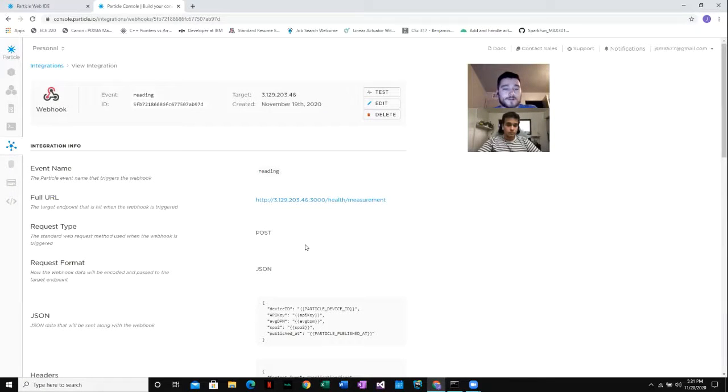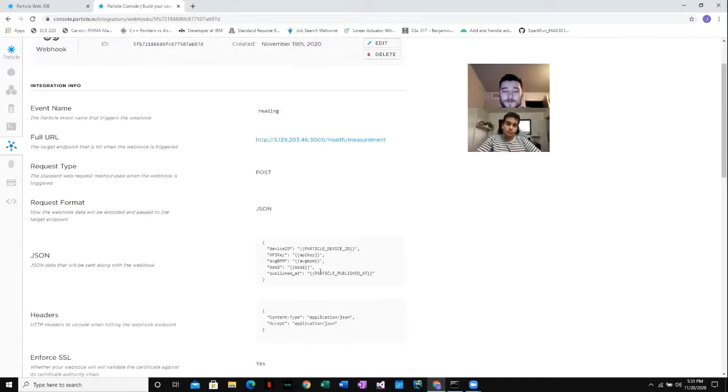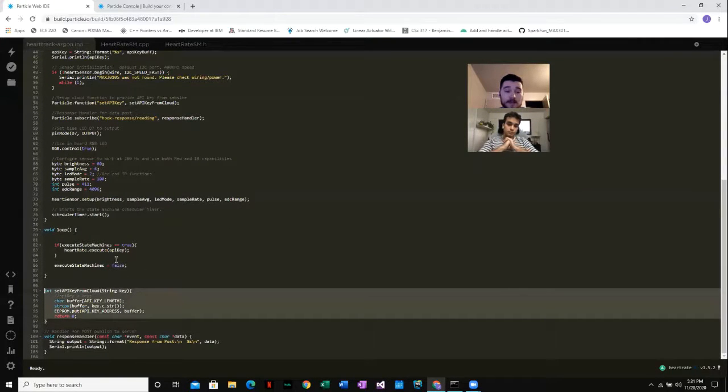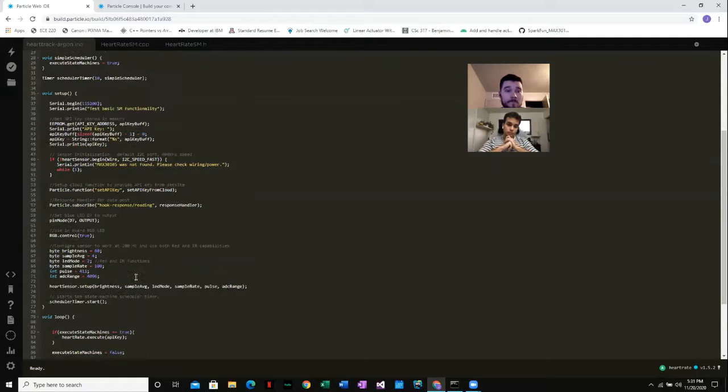I'm going to go ahead and show you the webhook that we have. It is connected to the server URL that Kevin showed earlier, and our endpoint is health measurement. That's where we're posting that information. We are posting the particle's device ID and the API key that's stored in the EEPROM. That's one of the reasons why we have to have the device on when you register it, because up here we do set a cloud function that will store an API key in the EEPROM.